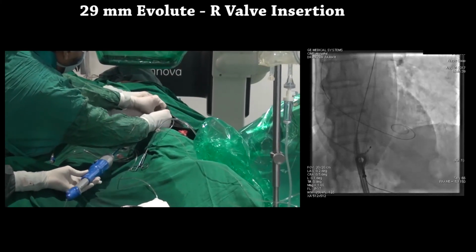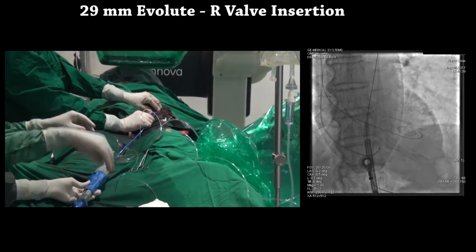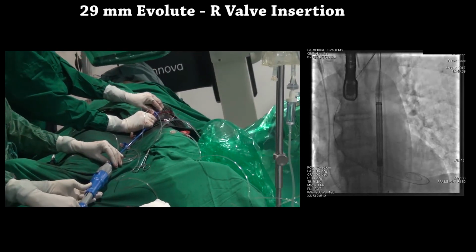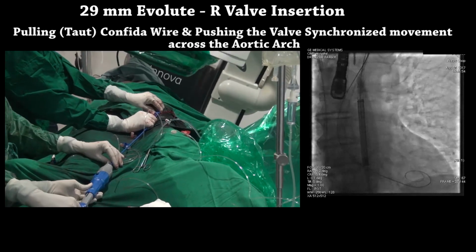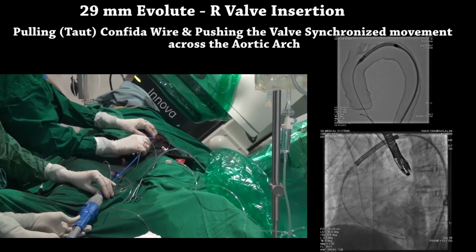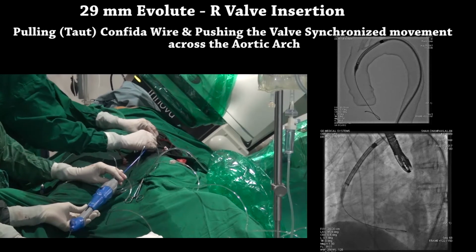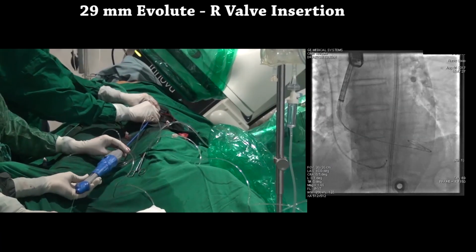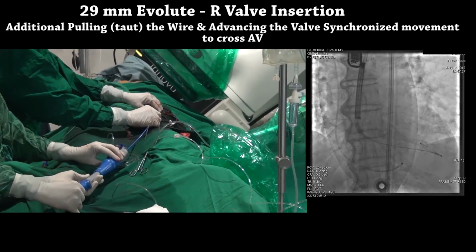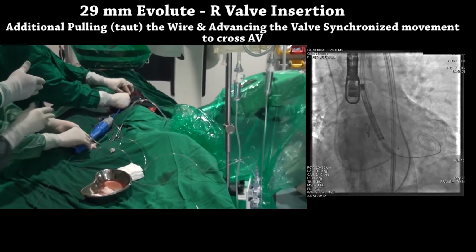And as you will see, we did find resistance and difficulty when we reached the aortic arch. At this time, the second operator started tightening the Confida wire with a taut feeling, and we were able to slide the Evolut catheter system across the aortic arch in a reasonably synchronized movement between the primary operator and the person who held the wire.